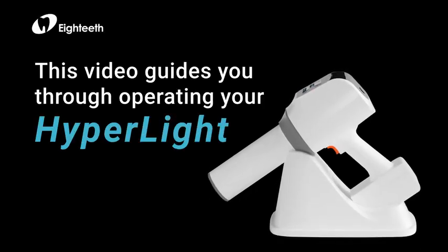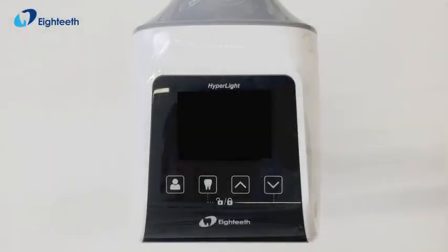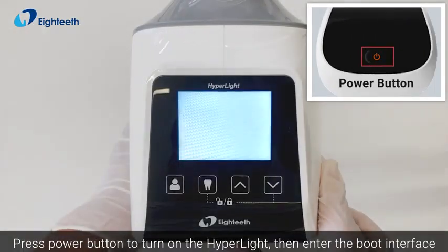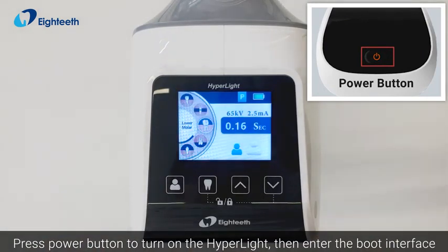This video guides you through operating your Hyperlite. Press the power button to turn on the Hyperlite, then enter the boot interface.